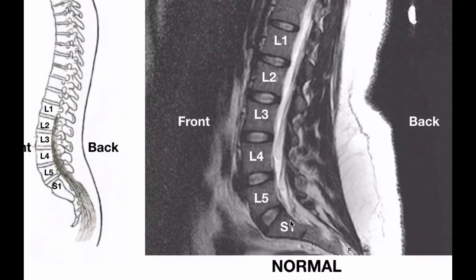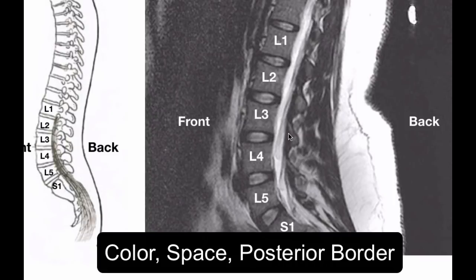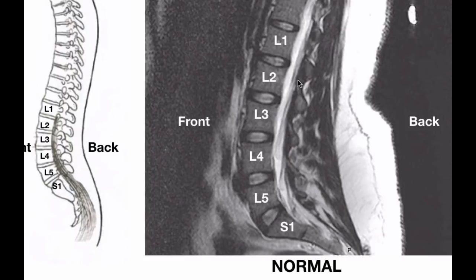Now what we want to look for as far as disc injuries is we're looking for 3 things. We're looking for color, spacing, and also the border, the posterior border of the disc itself. So if we look at L1 here, the vertebra is the block here. Then we have a disc below it. The white area is a disc, and then we have L2, the other vertebra, right below it. So in between every 2 vertebrae, we have a disc.